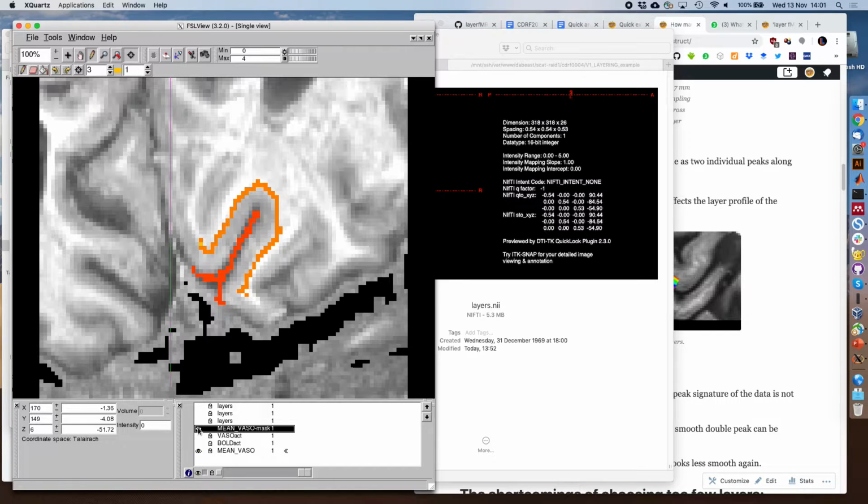Makes sense. And do you feel like, obviously in some ways you can gain information by upsampling your data, but if you make the assumption that the only information that you really want is gray matter information, then theoretically you would be gaining more within gray matter than at the border. Do you feel like that affects things? Because then you're kind of splitting up voxels that are in this border area where their intensities are changing.